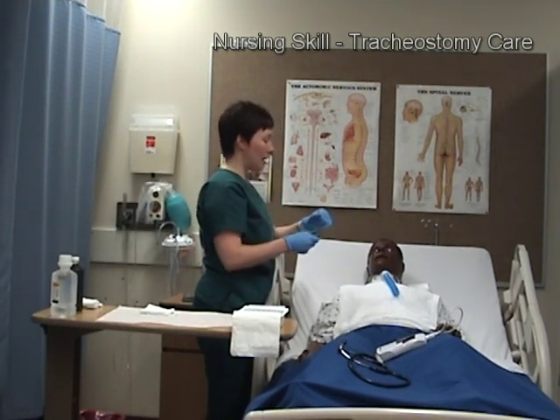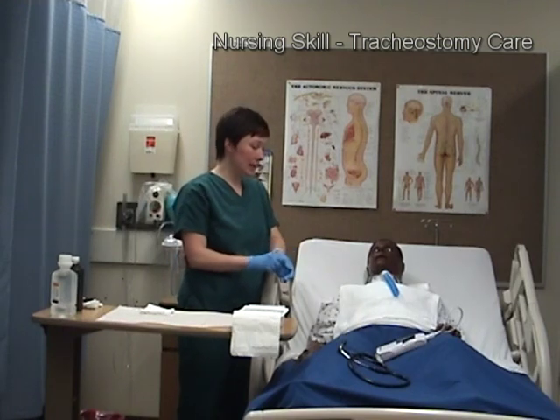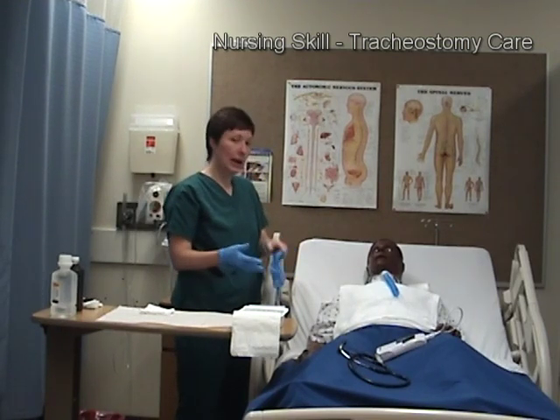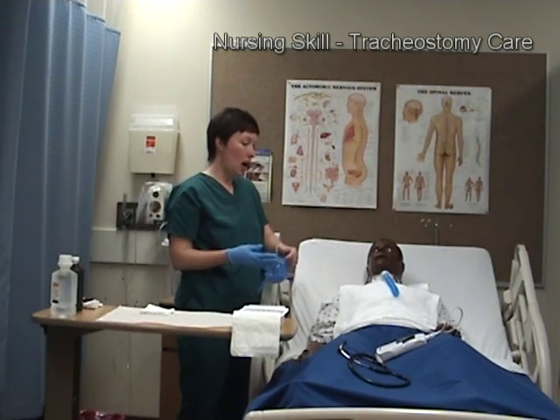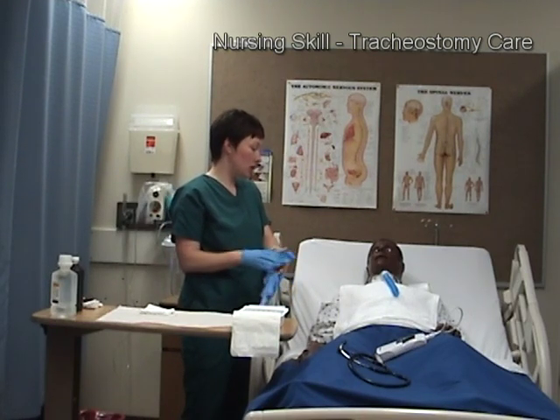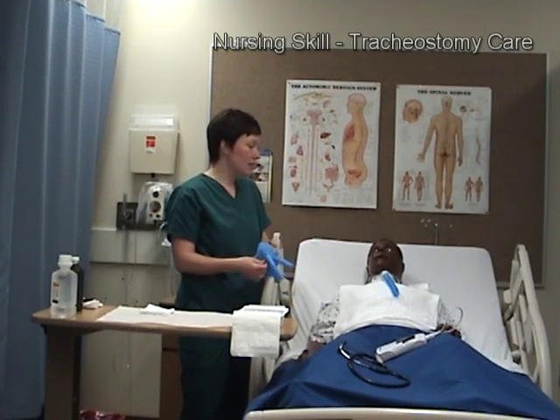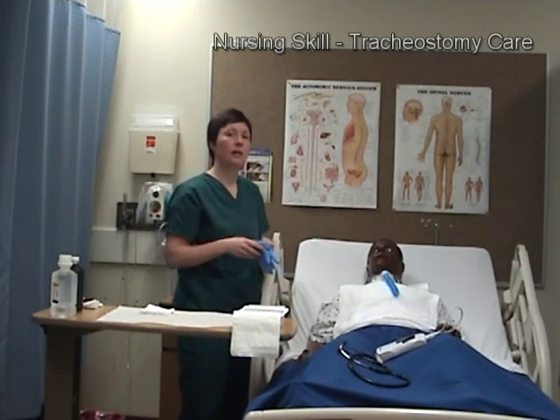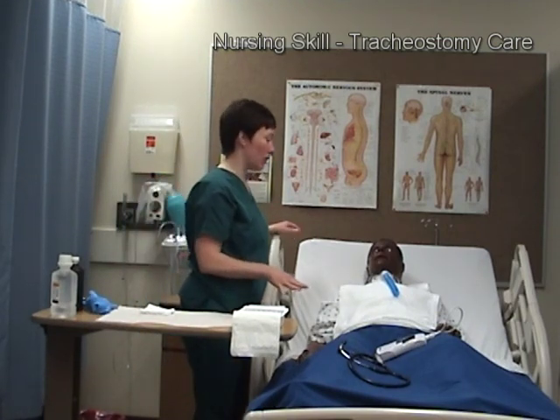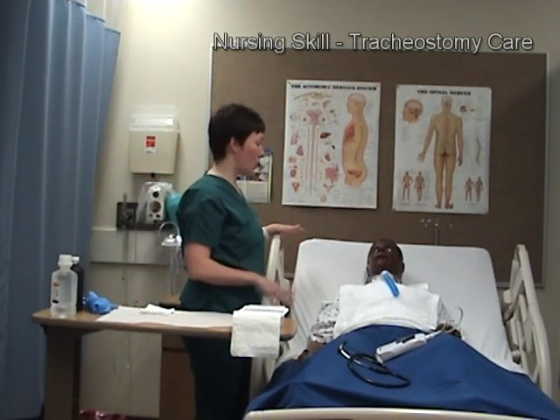I have now successfully cleaned and replaced the inner cannula of this patient's trach. Oxygen saturation is fine. I'm going to make note of any respiratory distress, listen to the lung sounds, and make sure the patient is feeling okay and has tolerated the procedure well, and address any questions they have.